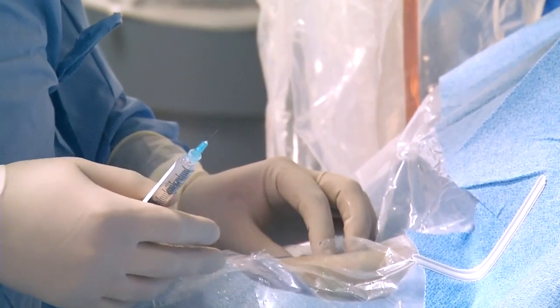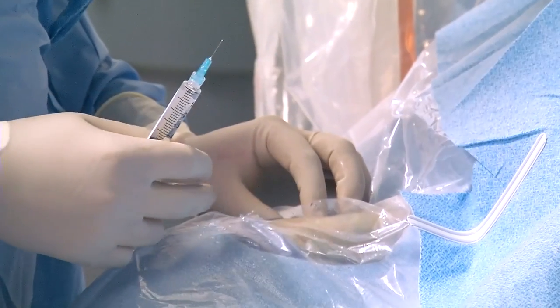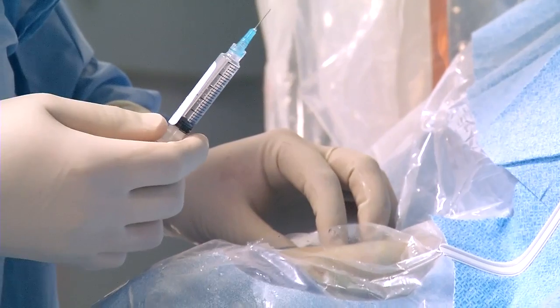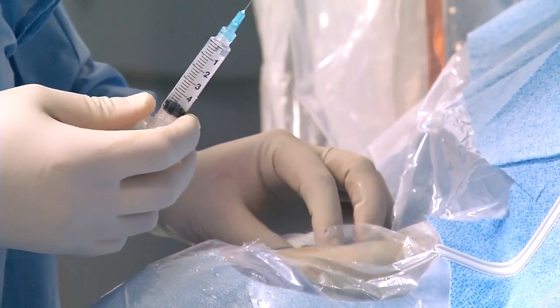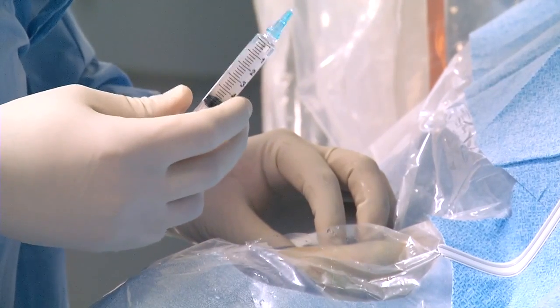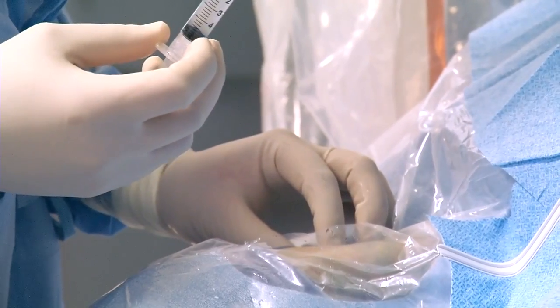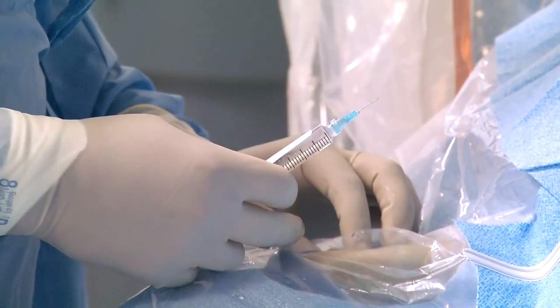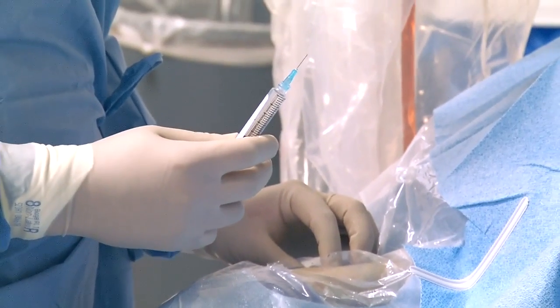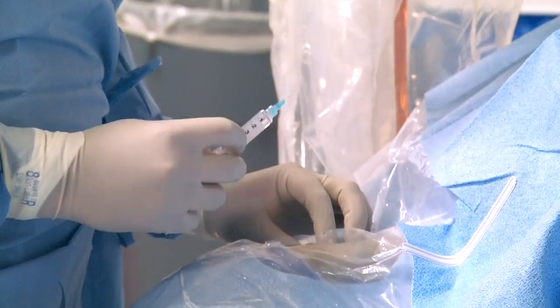So as far as finding where the ideal access site location is, we go about 2 to 3 finger breadths from the styloid process. Now, a common mistake that operators often make in the early phases is they access too close to the hand. They often may feel the pulse stronger closer to the hand, and from doing ABGs, that's a common site. However, the course closer to the hand is a little bit more tortuous, and it's a little bit smaller in caliber, so it's better to go about 2 or 3 finger breadths from the styloid process.